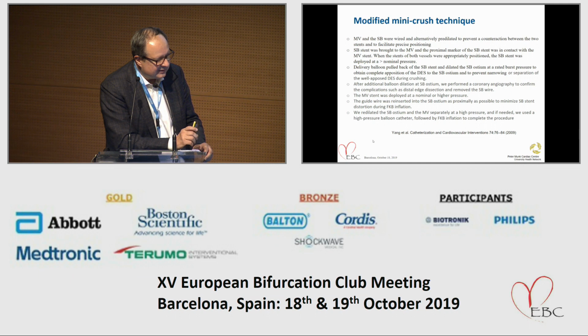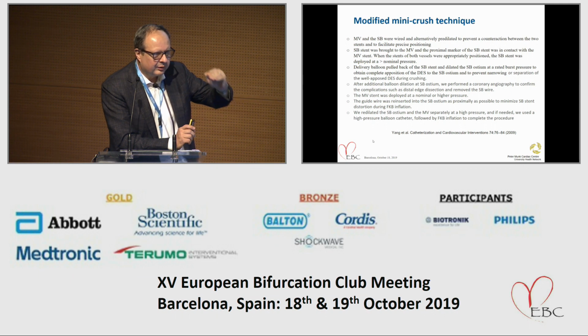The important thing is that this is almost like a nano crush, not quite, but almost, in that if you look at the second heading, the proximal marker ends up just touching the stent, no more than that. So not 2 or 3 struts into the main vessel, but where it just barely touches the strut, so you get really minimum stent material of a triple layer nature.